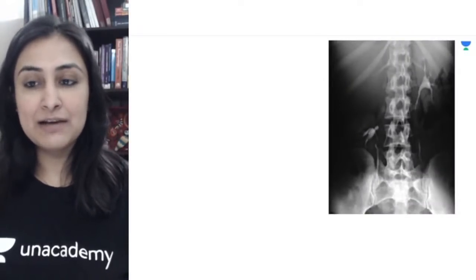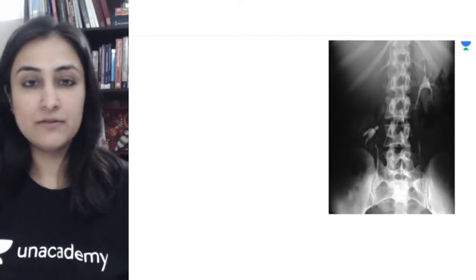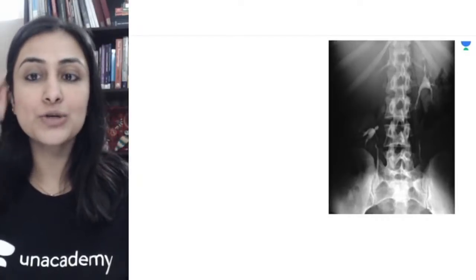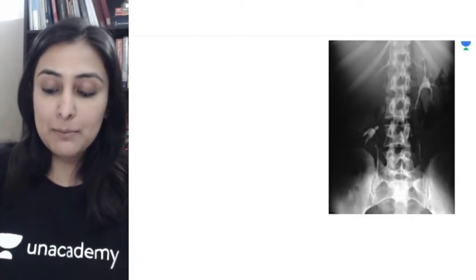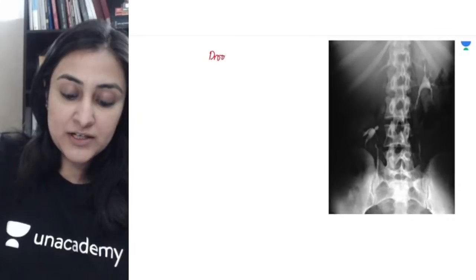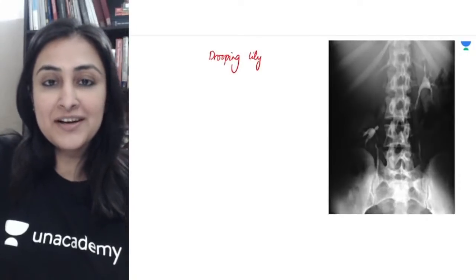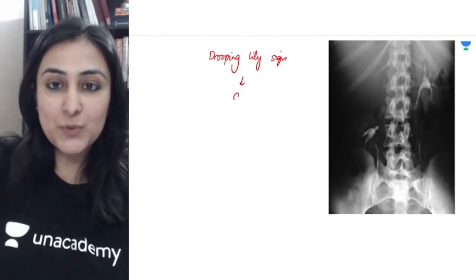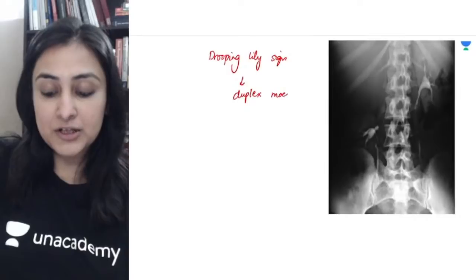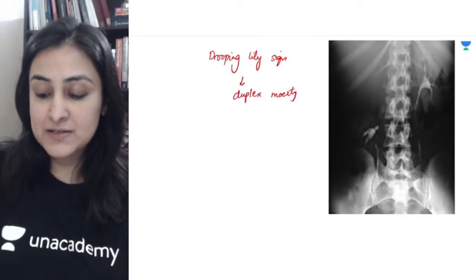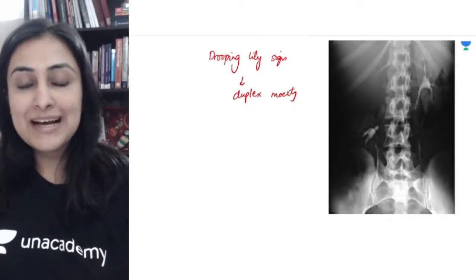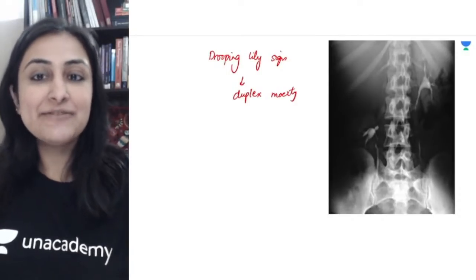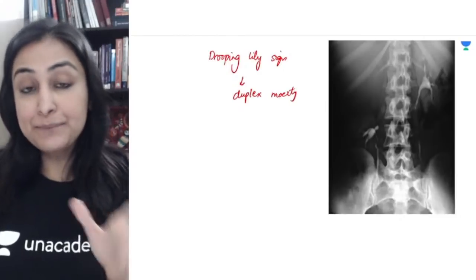The next image — tell me the sign. This is something every person attempting PG will know. The image itself tells you it's looking like a drooping lily. The drooping lily sign is seen with a duplex moiety. You can see very clearly on the right side that this pelvicocalyceal system is looking like a drooping lily, falling down and drooping.